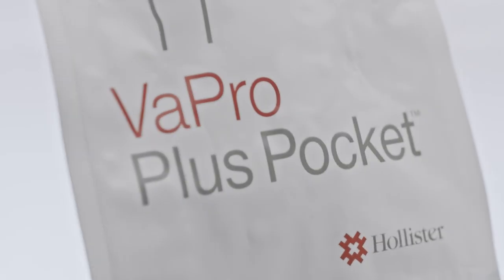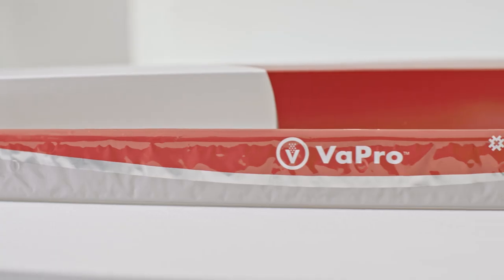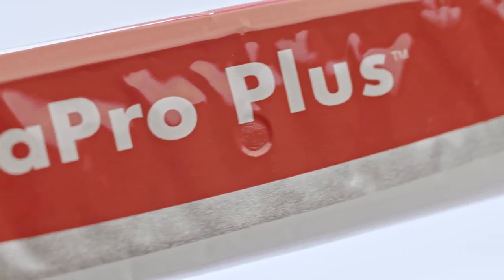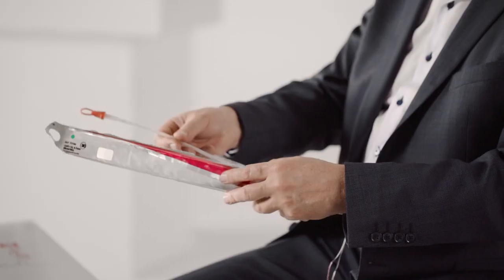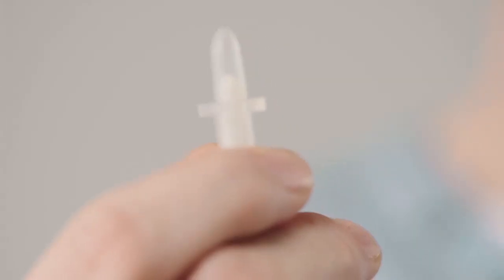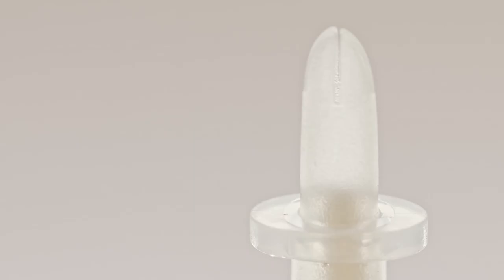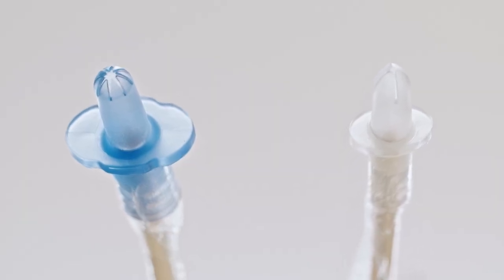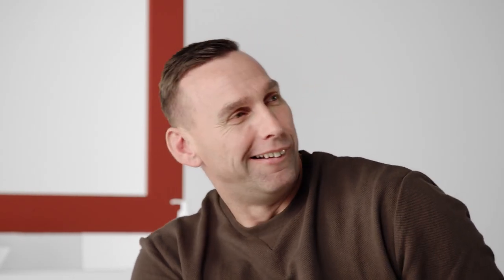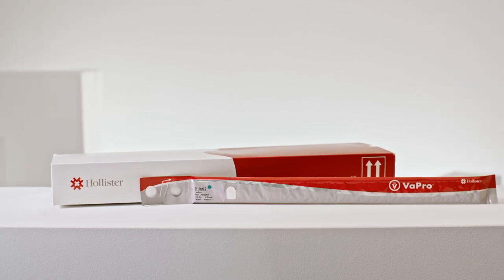Vapro catheters are offered in a broad portfolio with only one easy-to-use technique for all. All Vapro catheters provide 100% no-touch protection due to the protective tip and sleeve. The protective tip helps shield the sterile catheter from contamination in the distal urethra and helps reduce the risk of carrying bacteria into the urinary tract.